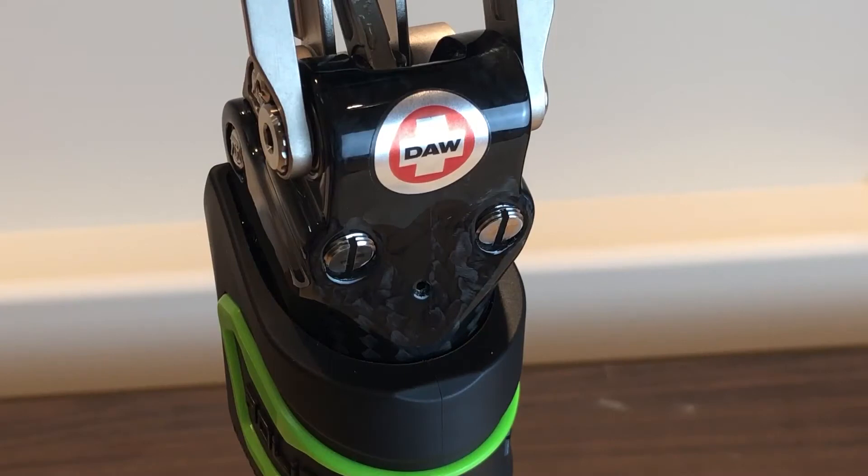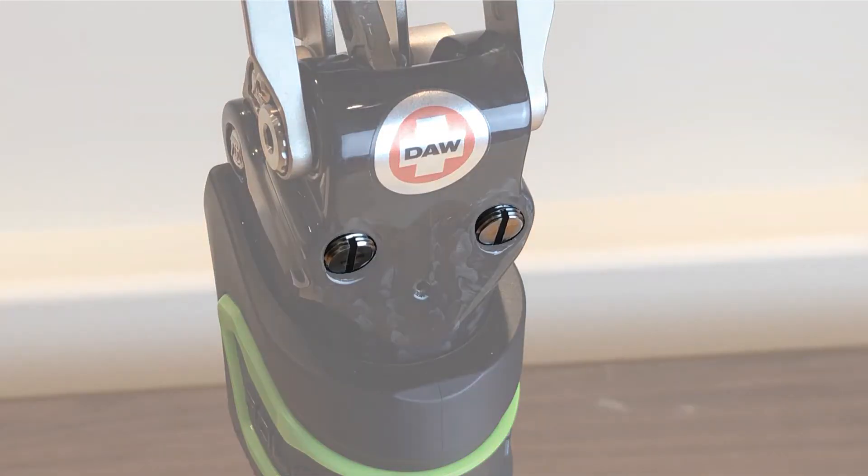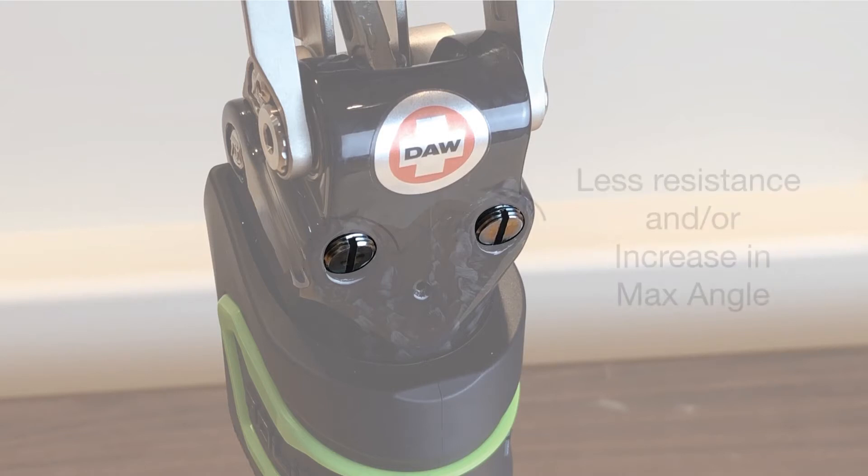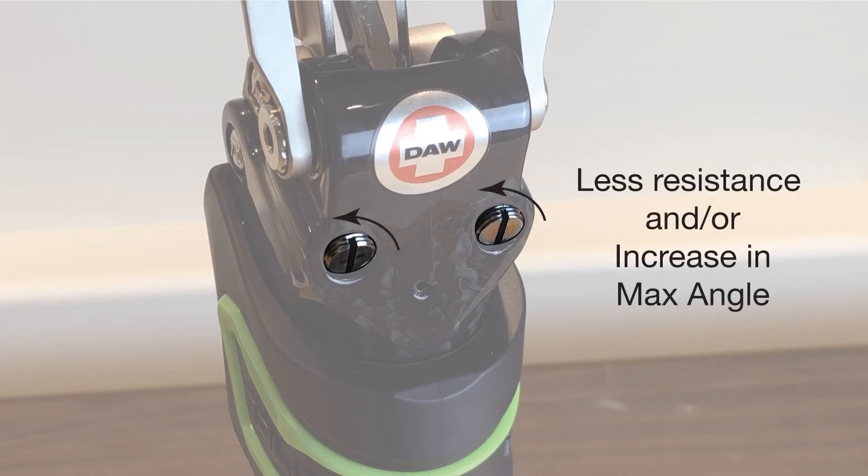To make your adjustment, locate the two flat head screws on the knee's interior side. The stance flexion adjustments are clockwise for more resistance and or a decrease in maximum stance flexion angle, and counterclockwise for less resistance and or an increase in the maximum stance flexion angle.